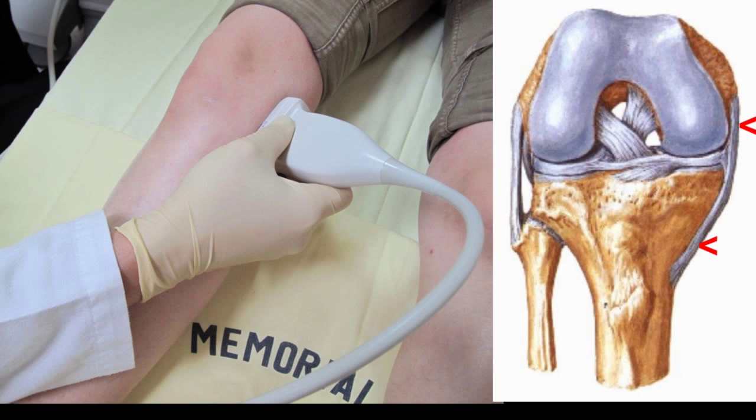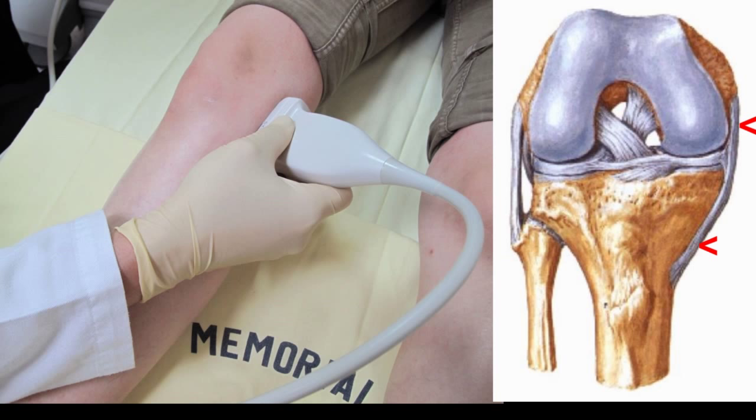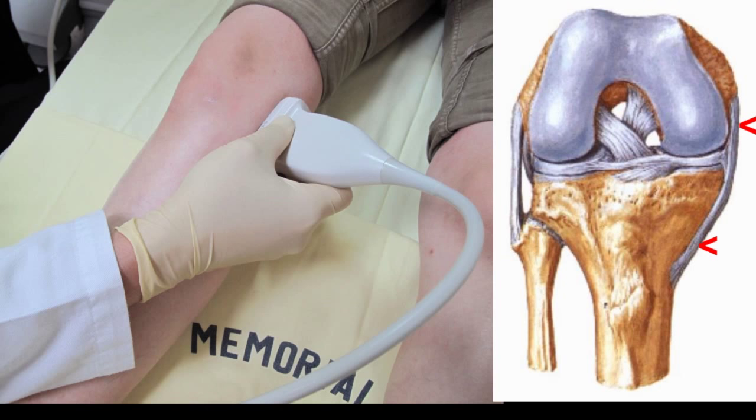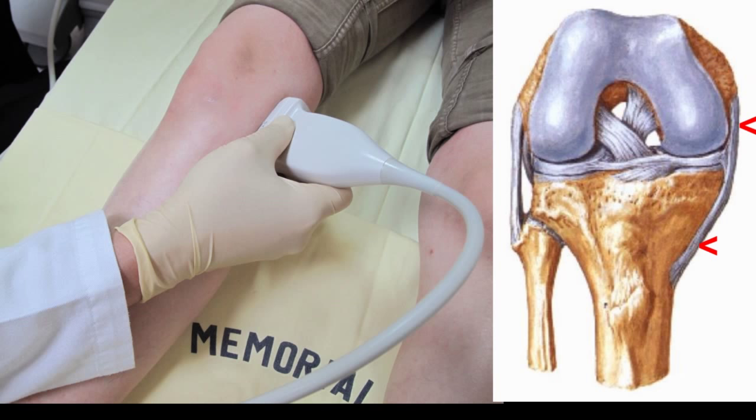Examining the medial collateral ligament. To examine the medial collateral ligament, the transducer is held in the longitudinal position parallel to the patellar tendon. The transducer is placed on the medial side of the knee.